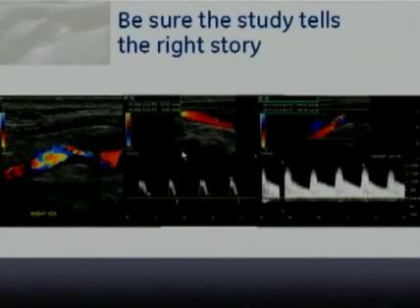And then the highest velocity she got as she sampled through the internal carotid artery was 200 centimeters per second. This could be right, but I'm suspicious that the velocity is probably much higher than that because when I have such a low velocity common carotid artery with high resistant flow, I would expect an even higher velocity reading in the stenosis. And in fact, this area of stenosis looks to be much tighter than that.